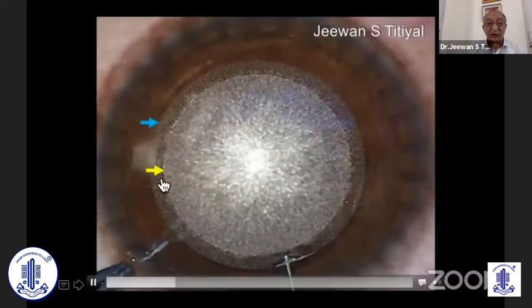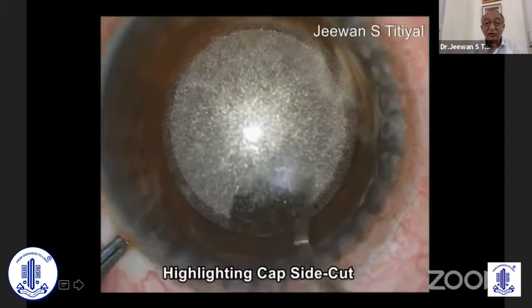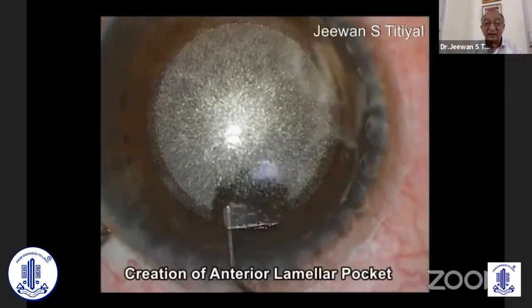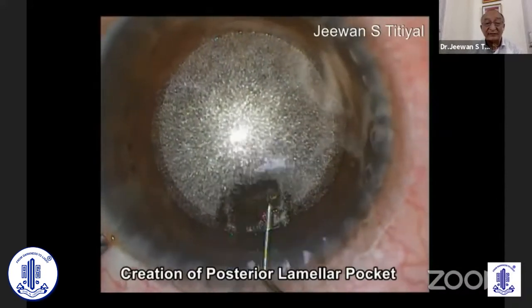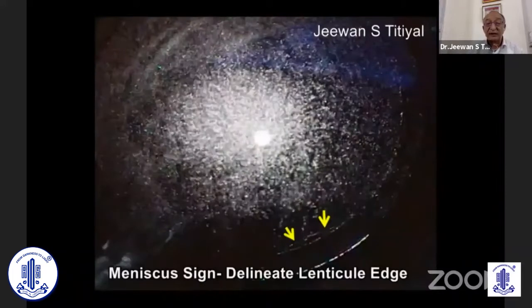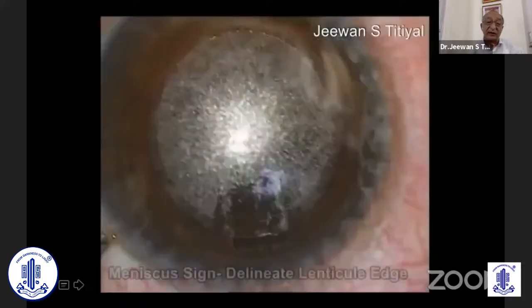So you have two clear margin rings — one is the cap, one is the lenticule side. This is the incision which is important to highlight. What I do normally is put a gentle massage on the incision site to delineate both rings clearly, then go gently from left to right. Make sure you are properly into the incision. Then I do an anterior pocket — this is a two millimeter incision. Then go towards the right hand side to create a posterior pocket. So I have both pockets now. Then take a dissector — I have clearly delineated my posterior edge, and this is what I have to clarify the lenticular edge, which is so important.